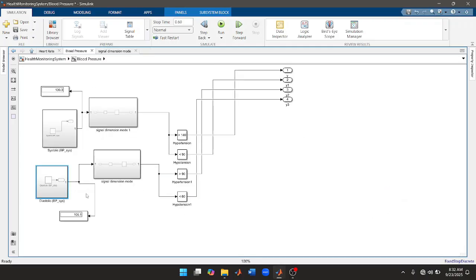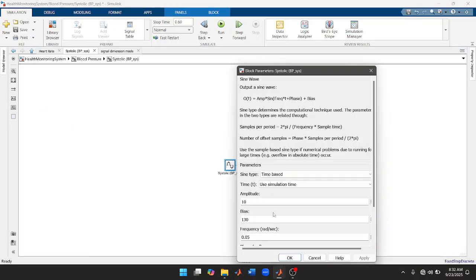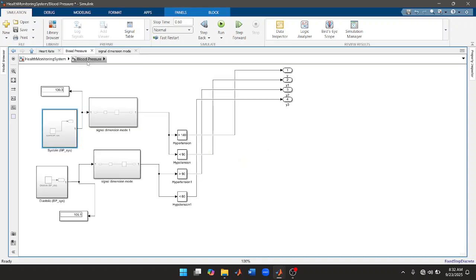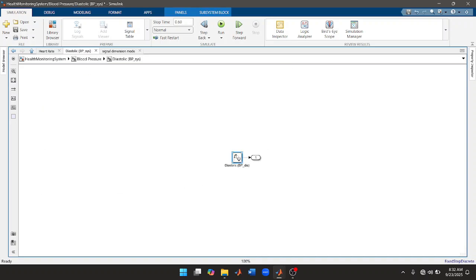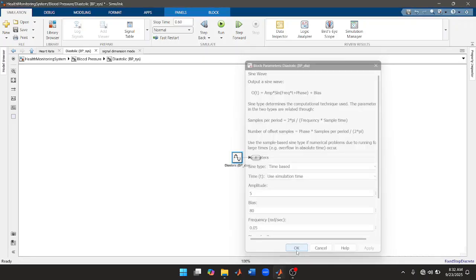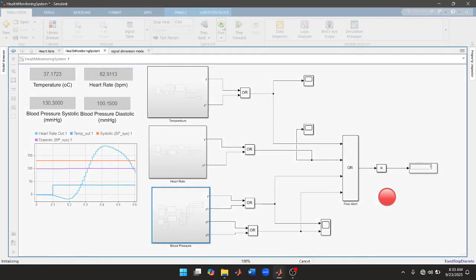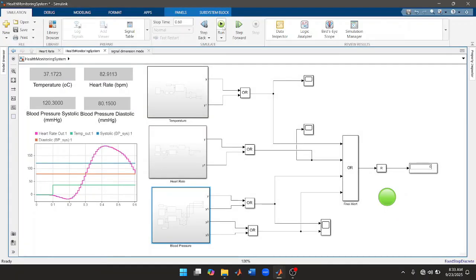So this system is a very simple, small system, and I want to run it again under normal condition. So if we have our normal condition, let's see that everything is back to normal. Everything is back to normal.